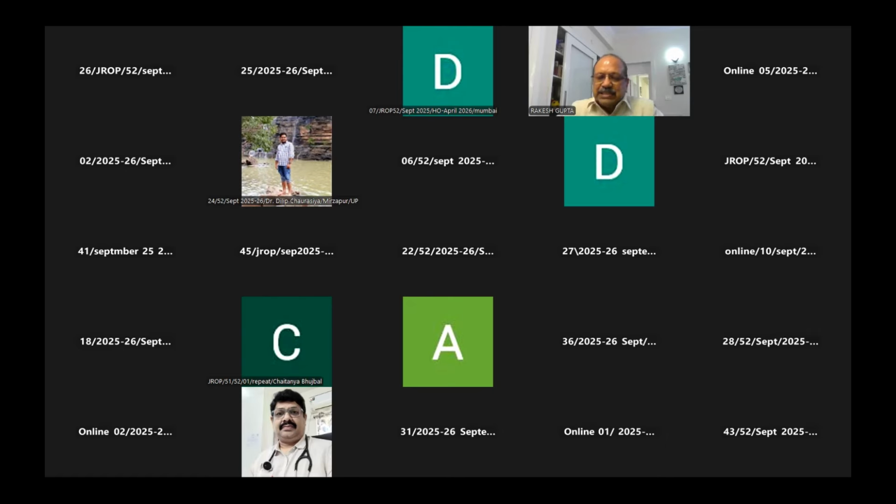Roll number 26. Sir, good evening, sir. I'm Dr. Swami. Yeah, Dr. Swami, go ahead. Sir, how can we measure endocardial thickening? Is it the systole and diastole difference? Measurement of wall thickness is always in diastole. In systole, they'll thicken. So normal thickness is up to 12 millimeters. Always in diastole. So systolic thickening means 1.2 to 1.5.